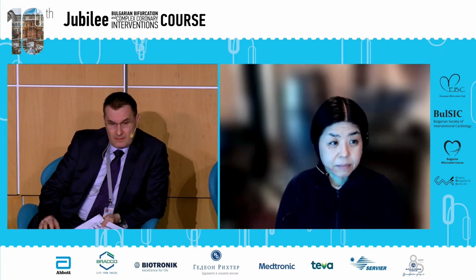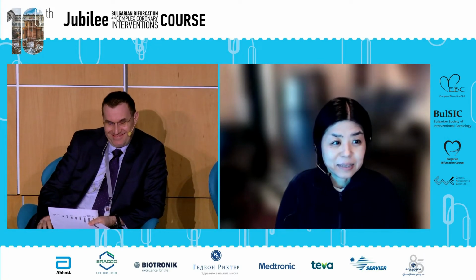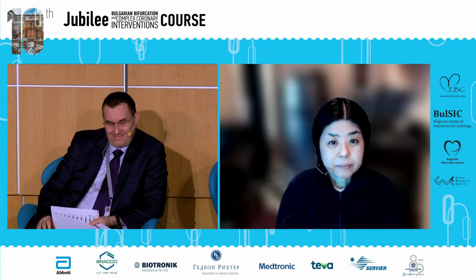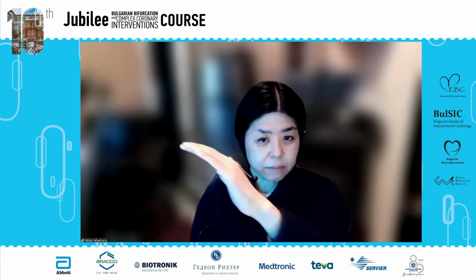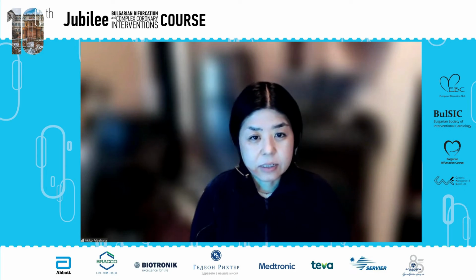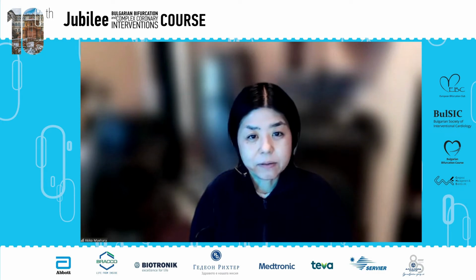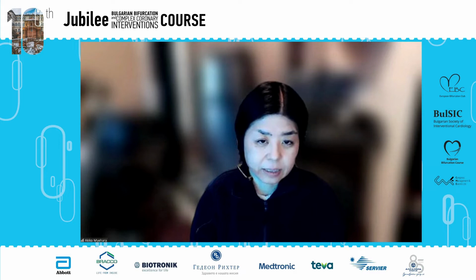Yeah, I think if somebody is treating, it has to be larger. And I think, as I said, we have to understand this is not an optimal criterion. Everybody uses the ROC curve, and this is really the best cutoff to find who is more likely to have a future event. It's not optimal. So whenever you do this type of ROC curve, if you go larger, there are fewer and fewer future events. So I think not only EXCEL, but even more than EXCEL, we have to achieve a larger area if we can.